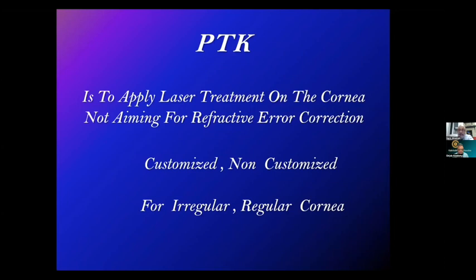This PTK could be customized or non-customized. Just plain PTK has a role, and we use it for irregular cornea. Also, we use it for regular cornea to induce irregular cornea.